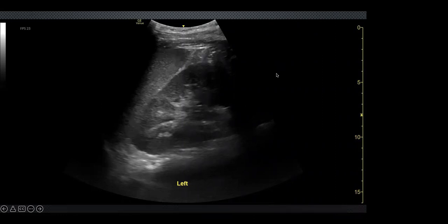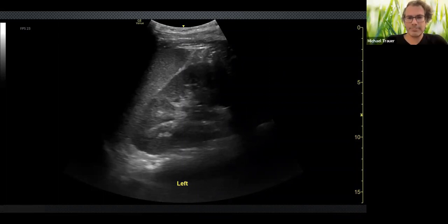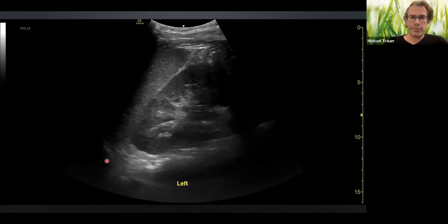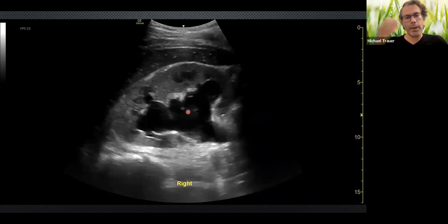Looks like this image looks normal. Good. Yeah, the pelvis is bright white, doesn't look dilated. Yep, great. So we have the spleen up here, just below that you can see a little bit of diaphragm, and then this is the kidney nestled in below the spleen. And as you said, you've just got this nice normal bright white sort of fatty sinus of the kidney with no real visible collecting system. So that's just normal. And then how about this one?